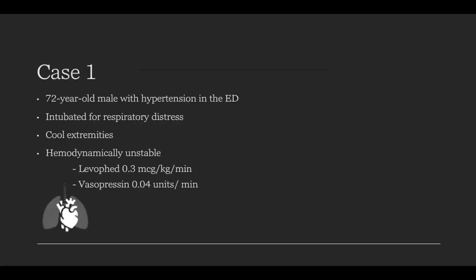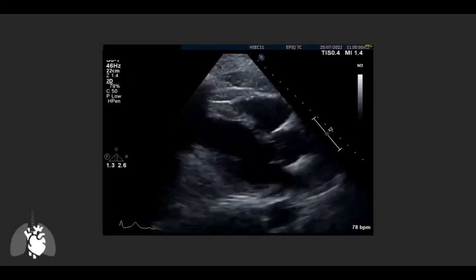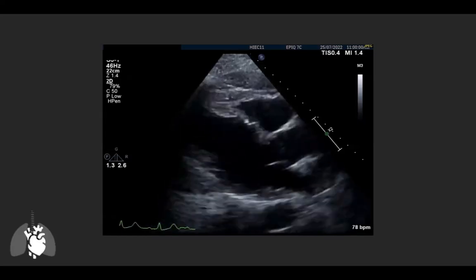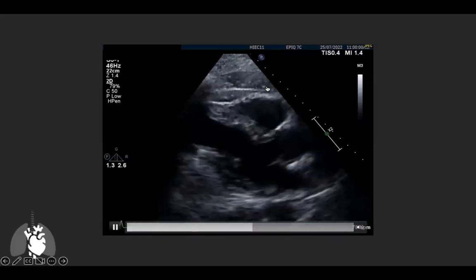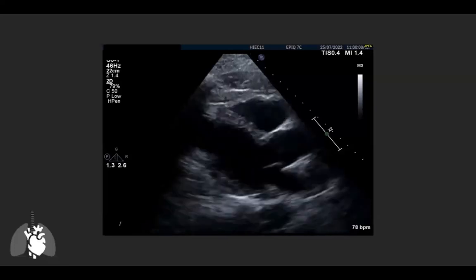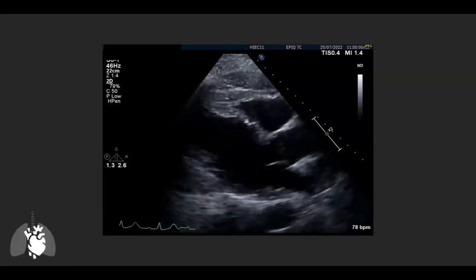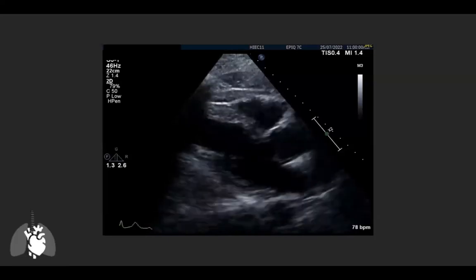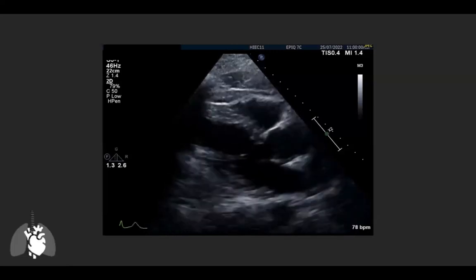Case one: a 72-year-old gentleman with hypertension, intubated for respiratory distress in the emergency department. He has cool extremities and is hemodynamically unstable on moderate doses of norepinephrine and vasopressin. On parasternal long axis, the basal anteroseptal and inferolateral segments contract reasonably well, but as you move to the mid segments, there appears to be a hinge point transitioning from normal thickening to hypokinesis approaching akinesis — mirrored on the inferolateral side.